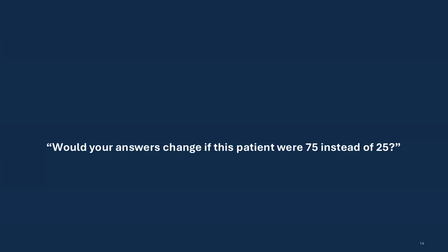After that, she presented with AF with a heart rate of 90 or 110. What will you do clinically for this patient, change the mode? We will, yes, and medically maybe give drugs, or something like anticoagulation.